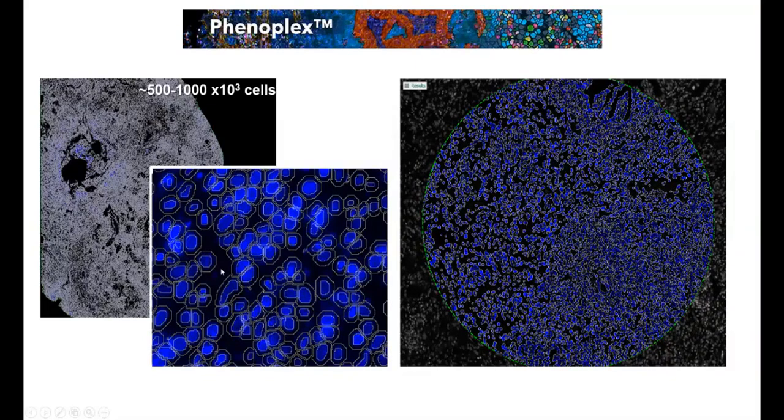So this is now giving us the huge advantage not only to detect the presence of regular biomarkers, but also to monitor the activity of certain proteins, since we can identify phosphorylated proteins or other types of post-translational modification, and whether they are changing their localization within the cell. So with that level of detail, now we can start understanding better the functional status of these cells.